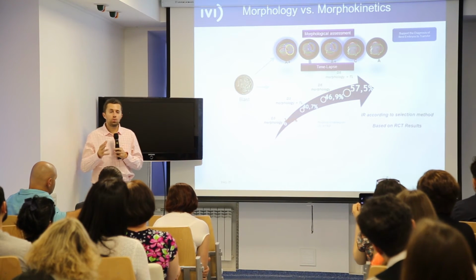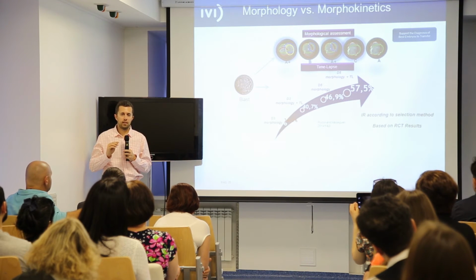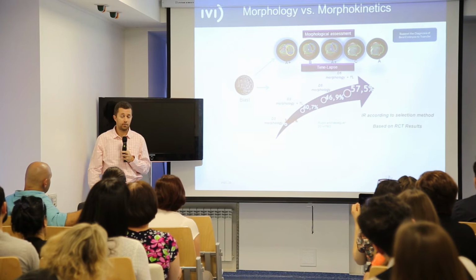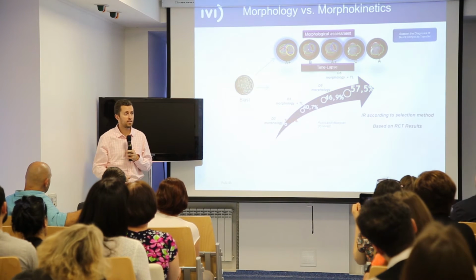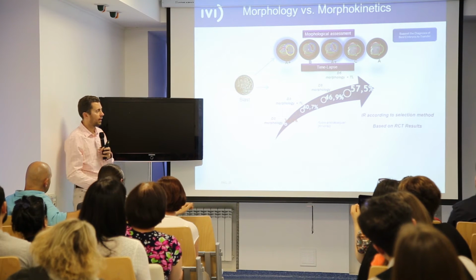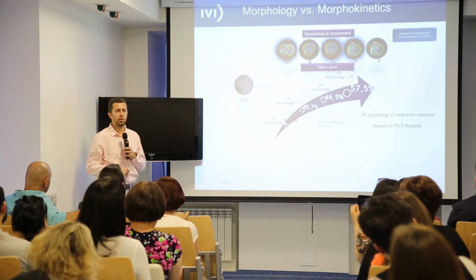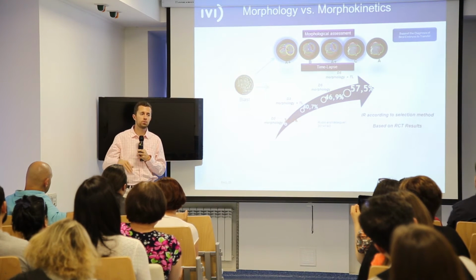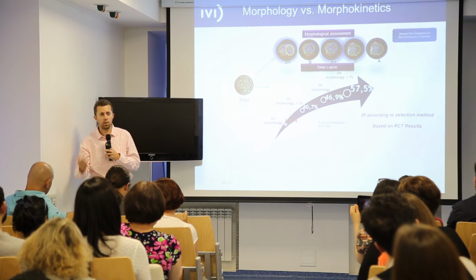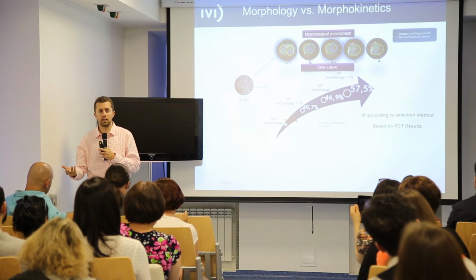One is that I do transfer on day 3. Let's imagine our standard cycles. Not talk about all, but let's talk about the standard cycle that we do, patients without indication of PGS. And we have these 4 options. We can do transfer on day 3, we can do transfer on day 5, we can do transfer on day 3 and combine with time-lapse, and we can do transfer on day 5 and combine with time-lapse.